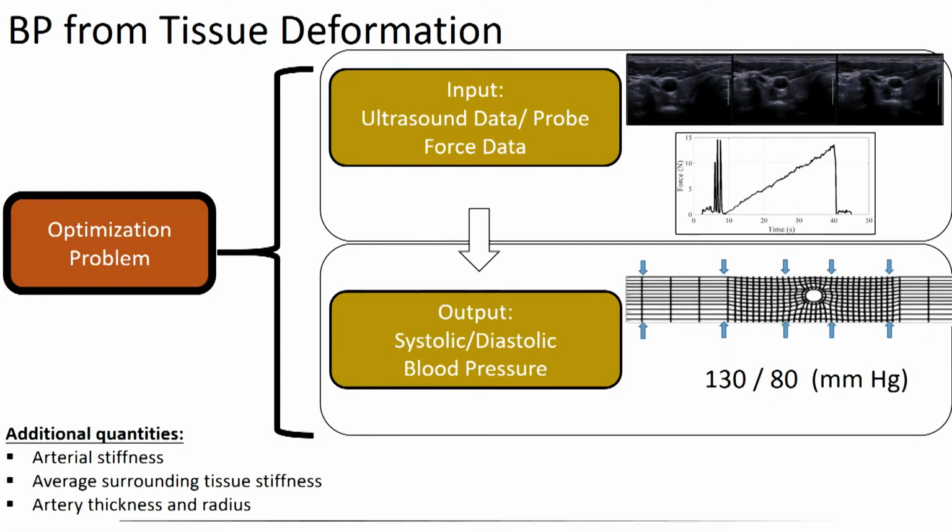So we have this data set now, and we really solved this massive computational problem, which, as it turns out, with enough work and a doctoral student working on it for 5 years, can get to the point where this massive computation runs in real time. As input, we use this ultrasound data as a function of known applied force. So at the top of this, the input is an image, and each image has an applied force associated with it.